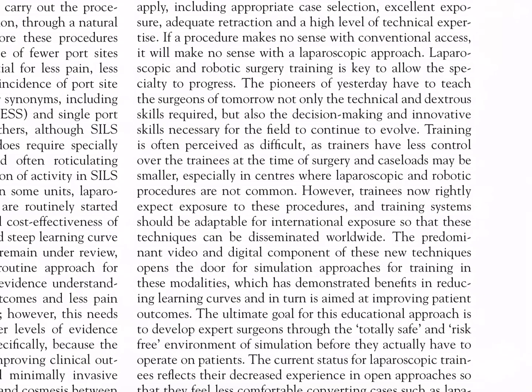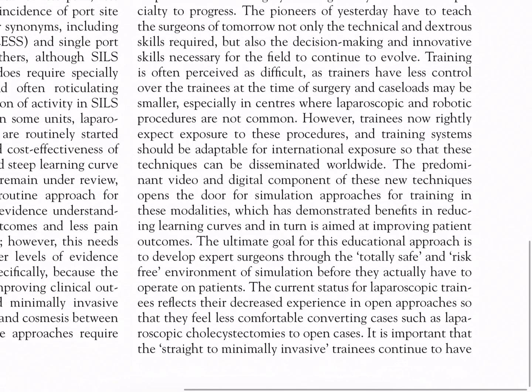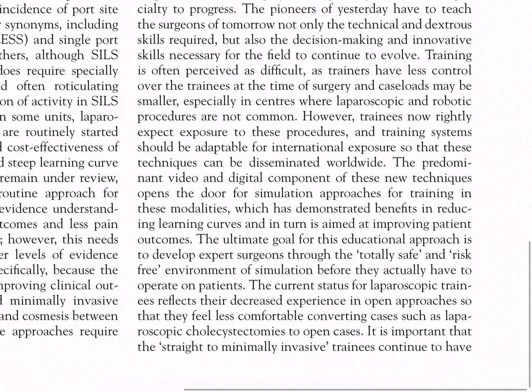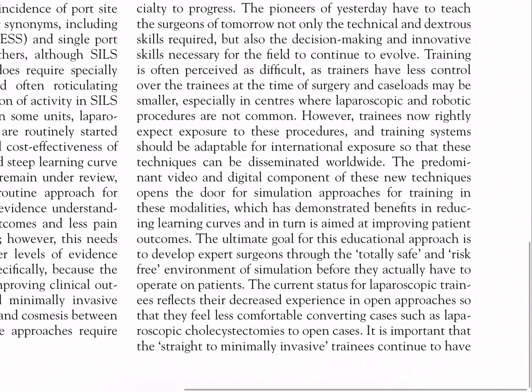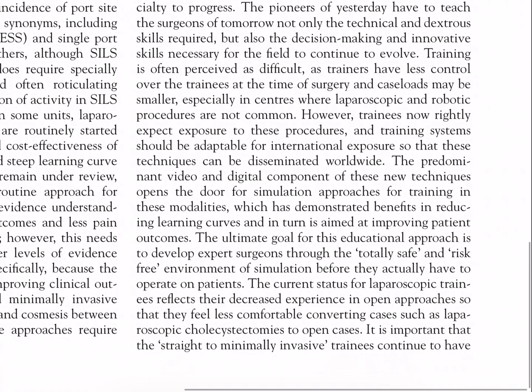The predominant video and digital component of these new techniques opens the door for simulation approaches for training in these modalities, which has demonstrated benefit in reducing learning curves and in turn is aimed at improving patient outcomes. The ultimate goal for this educational approach is to develop expert surgeons through the total safe and risk-free environment of simulation before they actually have to operate on patients.